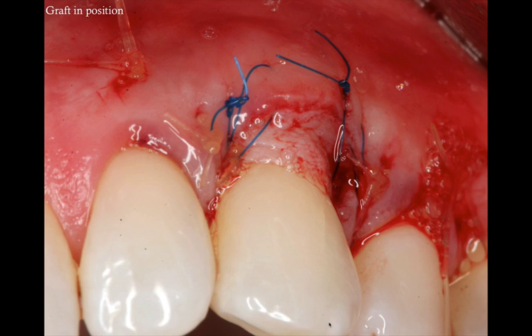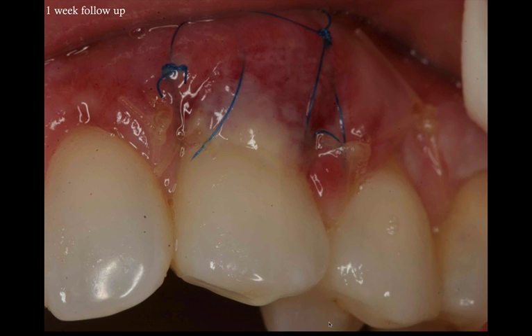I prescribed systemic antibiotics and pain medications and gave some oral hygiene instruction in the area, but no periodontal dressing or covering. Basically, this area needs to be left alone. So the patient came back a week later.